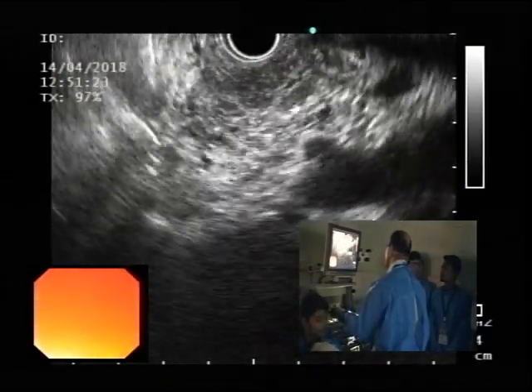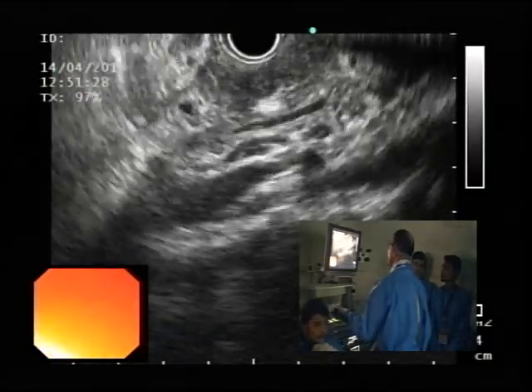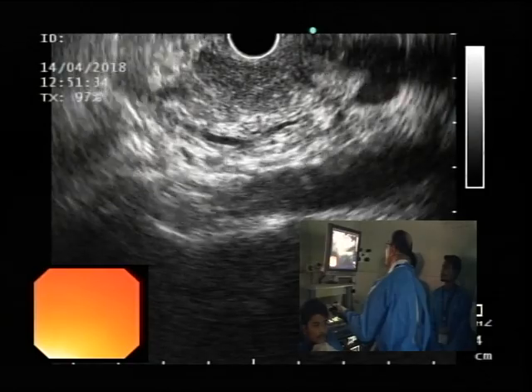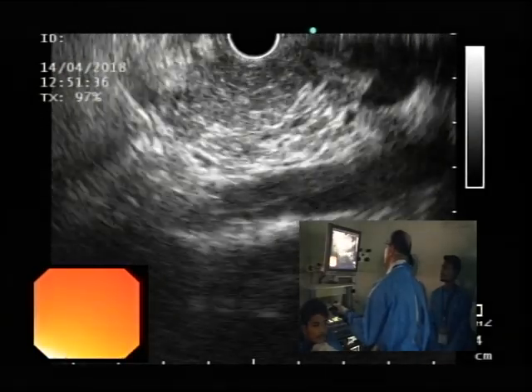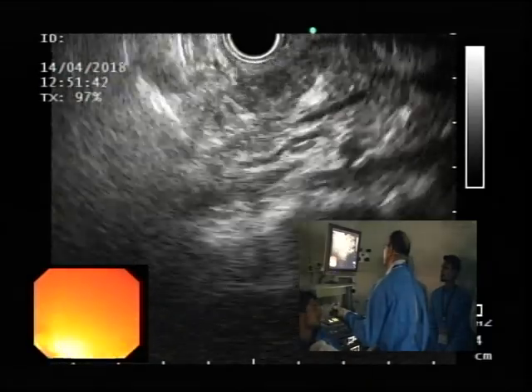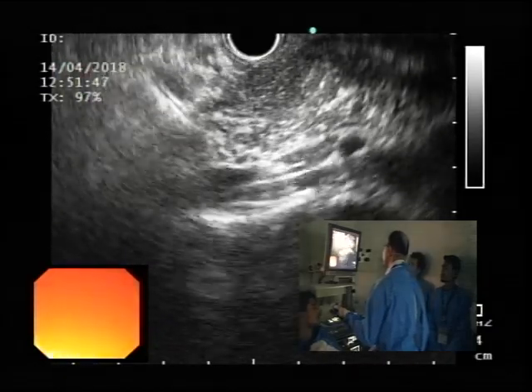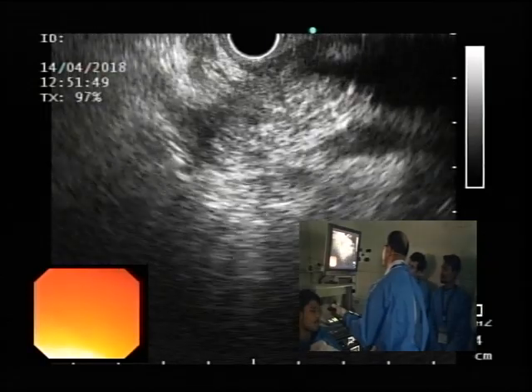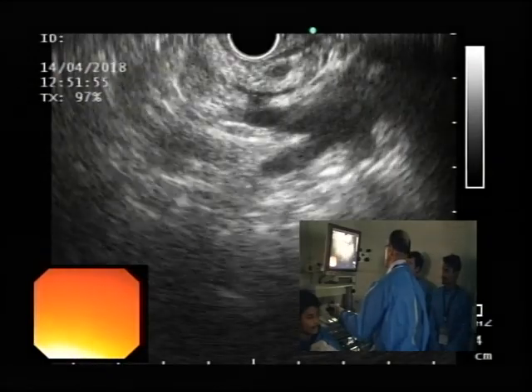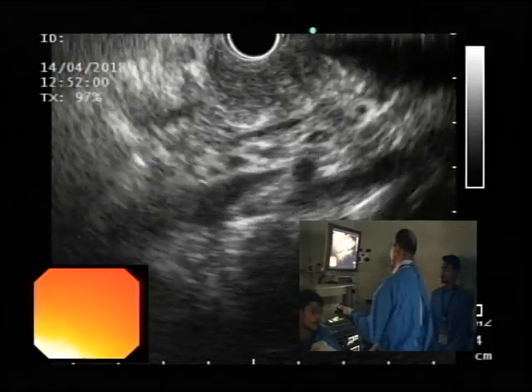Excuse me, Dr. Mustafa? Is it a possibility of pancreas divisum? Because I think I can appreciate two ducts separately. You mean in the pancreas? Yeah, in the pancreas. We can try. To me, this one looks like the bile duct. This is ventral pancreatic duct. It's incomplete pancreas divisum, I think. It's very possible. It's hard for me to demonstrate, I'll be honest with you. I'll show you. I'm trying to see if I can get it.